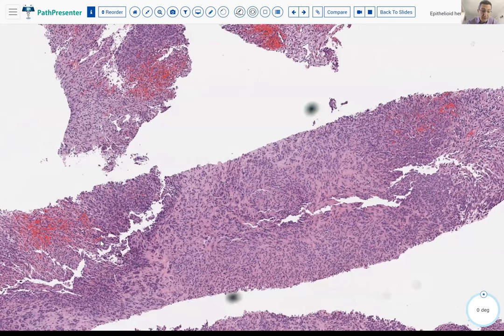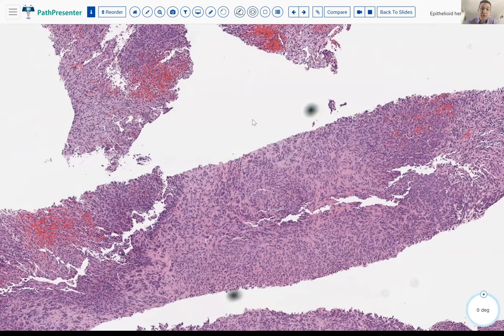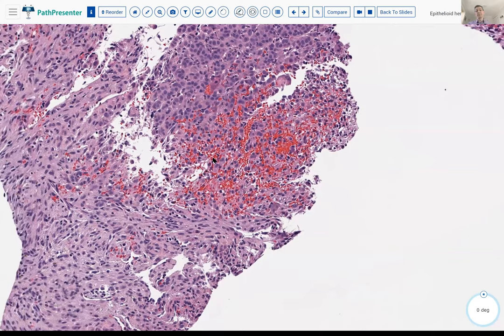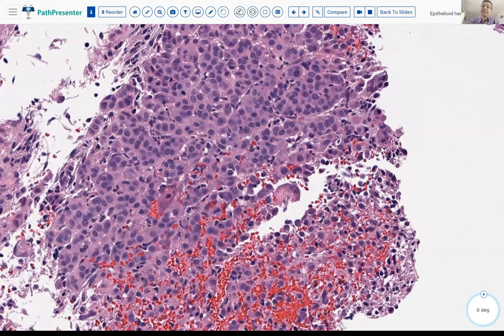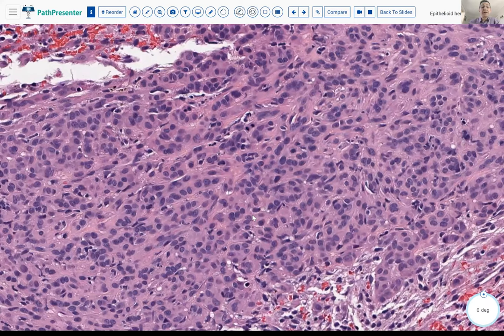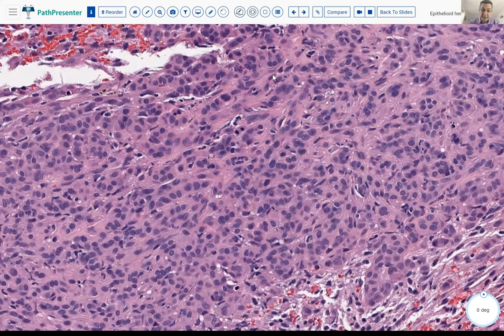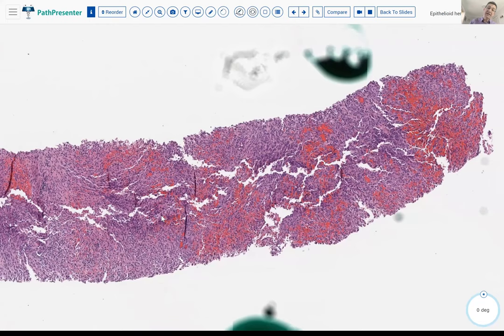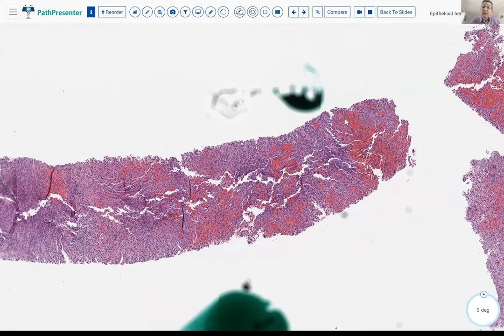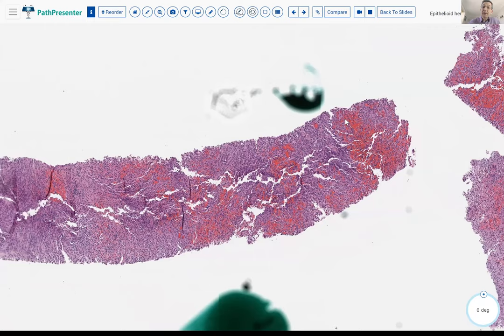There are more spindle areas, more epithelioid areas, and extravasated red blood cells. Since it's a bone tumor, the first thought is metastatic carcinoma. You proceed step by step with immunostains: keratin, S100, maybe desmin and SMA. Let's say it had some positivity for keratin but was negative for S100, desmin, and SMA. But one stain we also did — which shows very nice nuclear staining — is ERG.